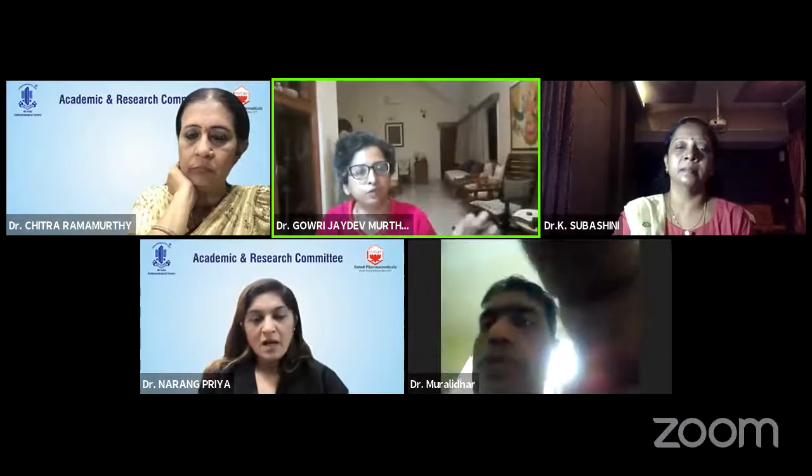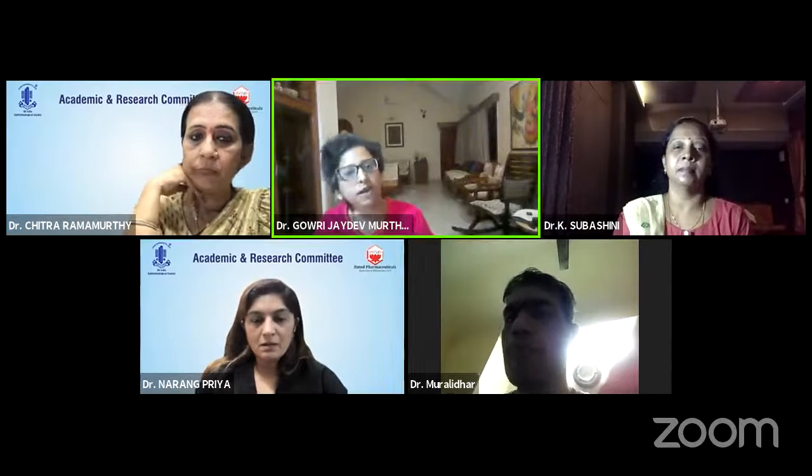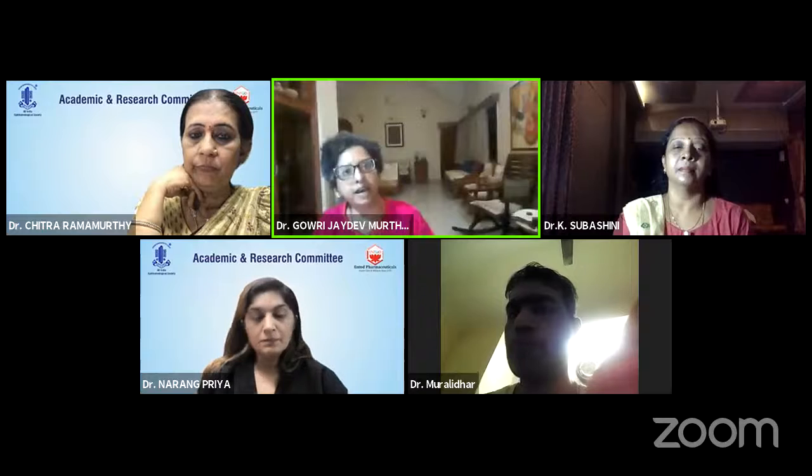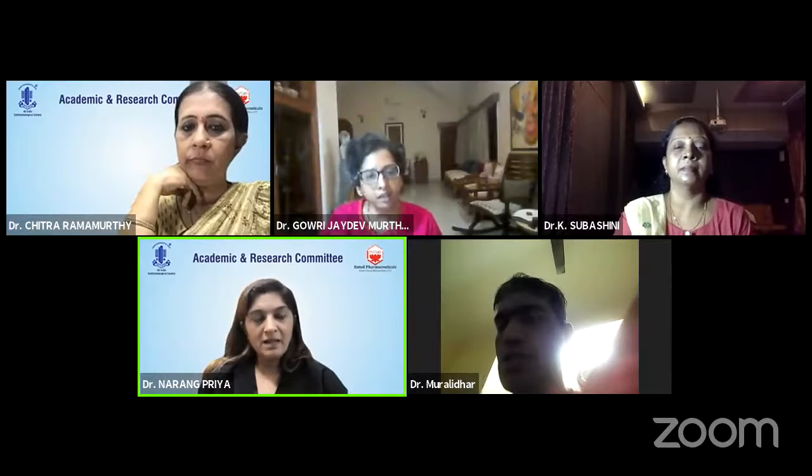My own worry, Dr. Murli and Dr. Priya, is that this is, of course, an emerging technology that holds a lot of promise, but the technology needs to be stable for us to use it effectively in our patients for follow-up and progression, because we're not talking about 1 year or 2 years, we're talking about a long period of time. So till the technology becomes stable, what is the place of this virtual reality based visual field? The future of this device is quite bright. But right now, you yourself said that it is being updated. It's something which is changing, just like nerve fiber layer analysis was changing in the initial period.